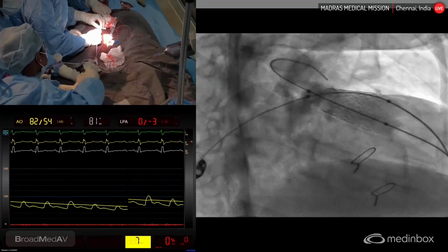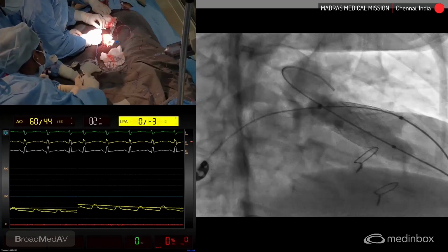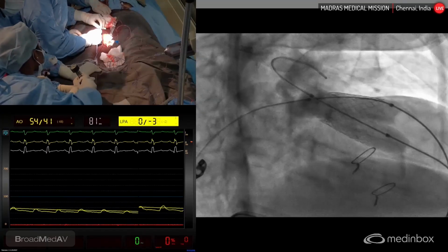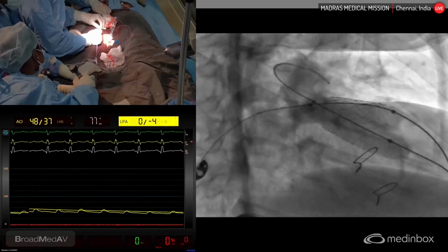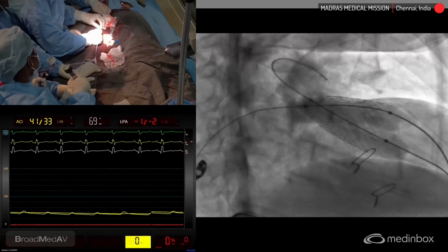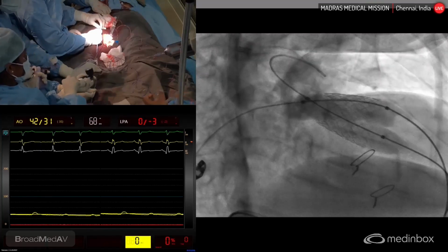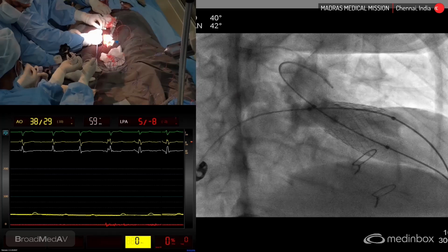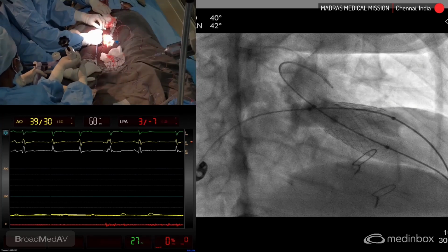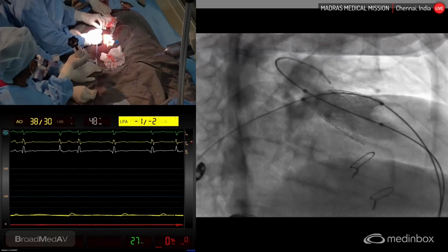11. Go to 11. Go to 11. Go. 11. Is the other person also going to 11? 11. Okay, deflate both. Deflate both. Fast. Fluoro store this. Pull back. Yeah. Fluoro store this.